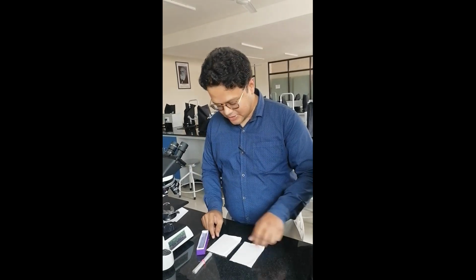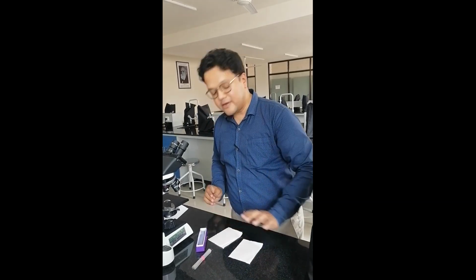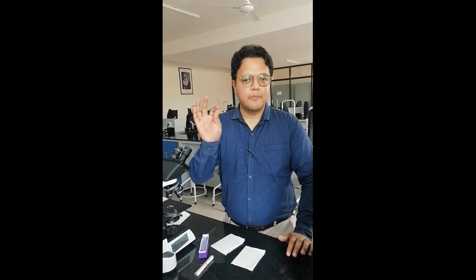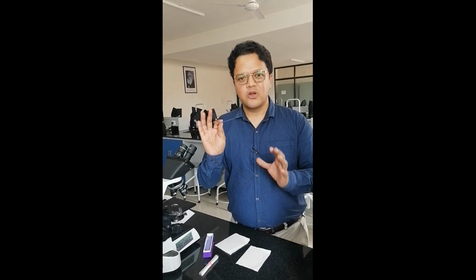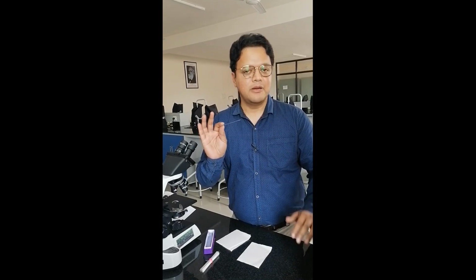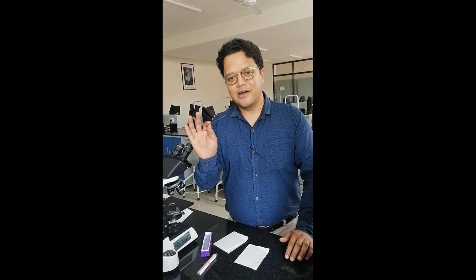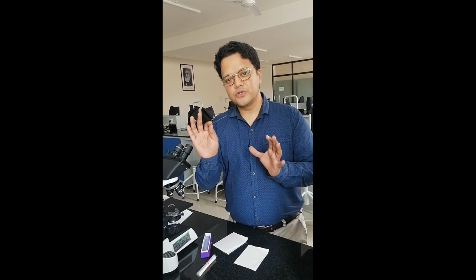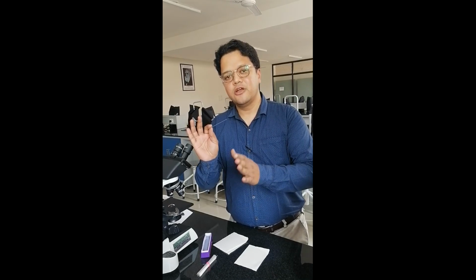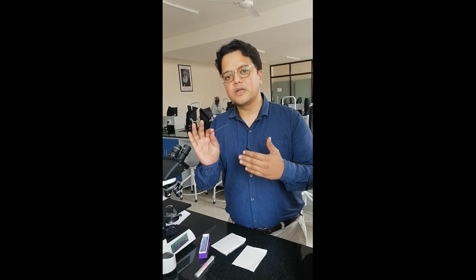Okay. So let's proceed with the clotting time. In clotting time, the method you are going to use is the capillary tube method. It is always good to know one or two other methods which can be used even for the bleeding time. So clotting time, same thing, know the definition and know the normal clotting time, and you should know in which condition the clotting time is prolonged. The discussion will continue on whatever you answer accordingly.